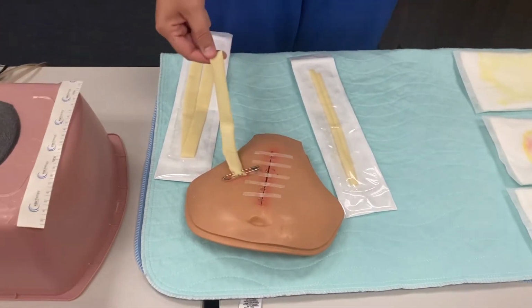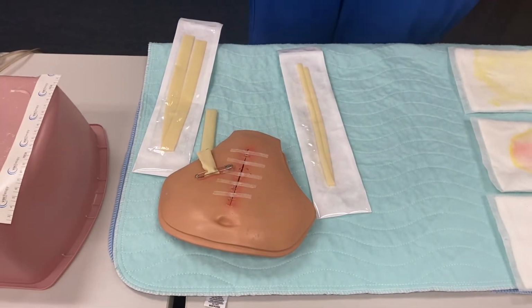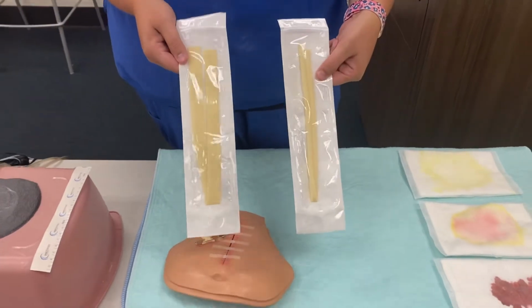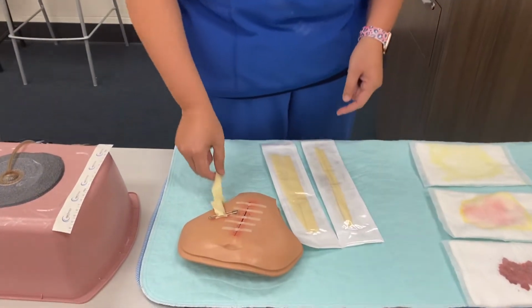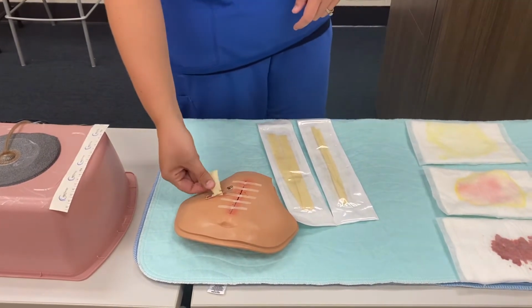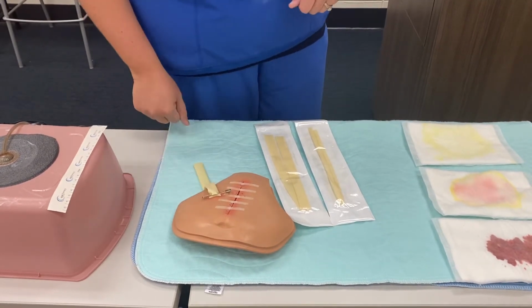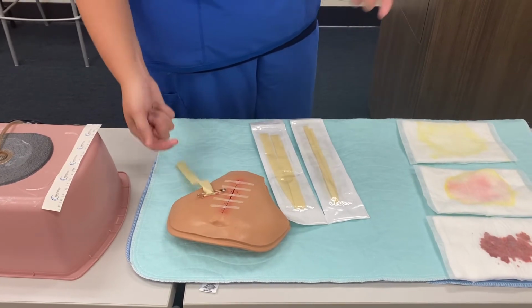So this is one that we usually are going to use for abscesses a patient may have. And you see they come in different sizes. There's little bitty ones, and there's great big ones. Okay, and if a patient has an abscess, the surgeon will place it, and it's going to help provide a way for that exudate to drain out, okay? So this one drains by gravity. It's just left laying there.